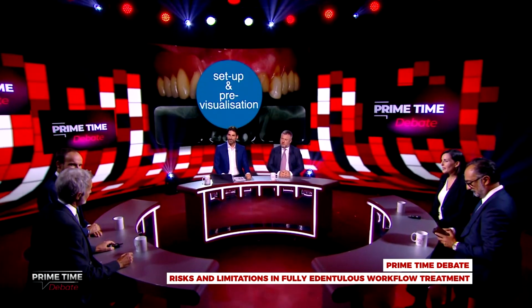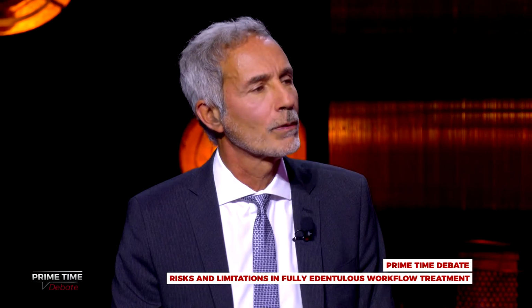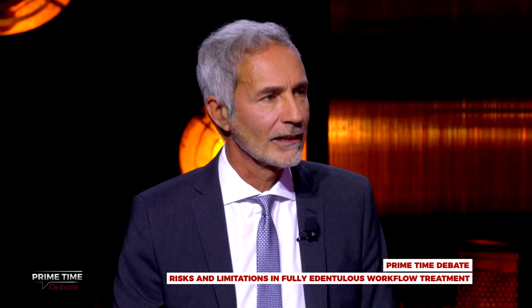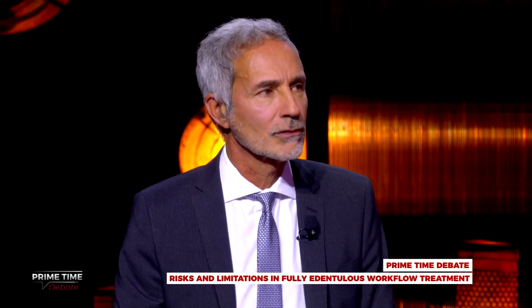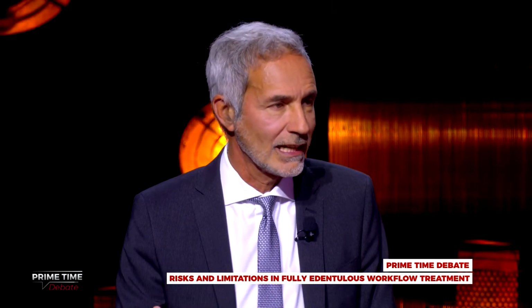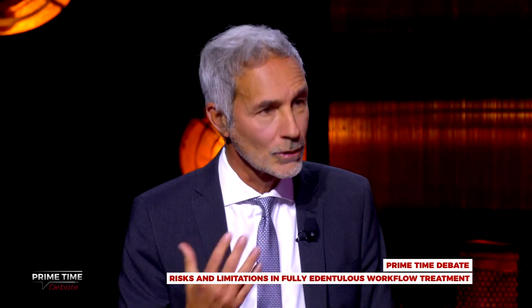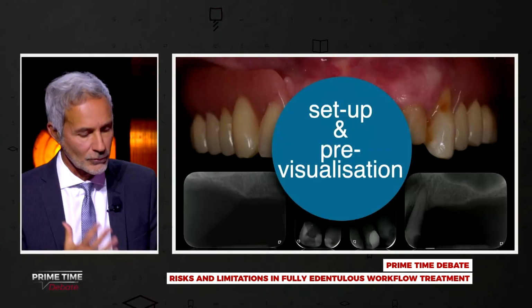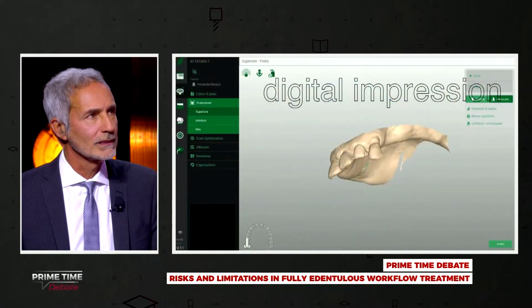Yes, this is the case. A lady with some hopeless teeth in the frontal area that cannot be maintained, and of course, we cannot start from the surgical side. We need a setup, a pre-visualization, in order to understand which is the ideal rehabilitation for that specific patient. The first point is to take an impression.